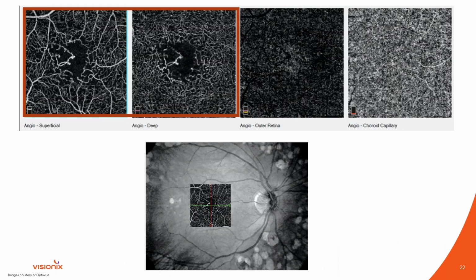Here you can see the 4 slabs on top that we talked about before. I have the red box focusing on the slabs of interest, and you can appreciate, wow, the really anomalous FAZ, this very anomalous capillary loop here, lots of microaneurysm formation, just a lot of blunted vessels that are just stopping midair, and in the deep plexus as well.